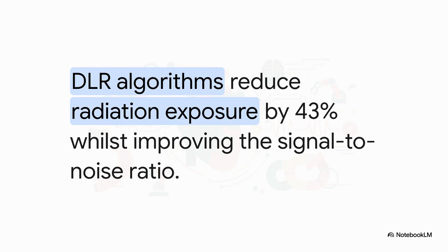That's the million-dollar question. Historically, to get a true, reliable functional assessment, you simply had to insert a pressure wire during invasive coronary angiography. That's the invasive FFR, our undisputed gold standard. Then, to avoid the invasive nature of that, we developed computational fluid dynamics, or CFD, to estimate FFR non-invasively from CT scans. But let's be totally honest, CFD is computationally heavy, it's slow, and it relies heavily on pristine image quality.